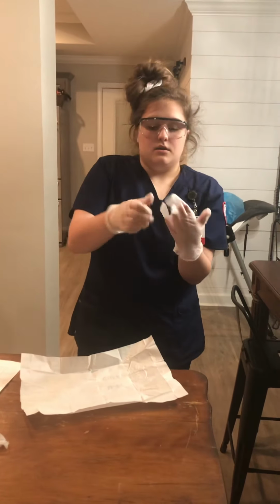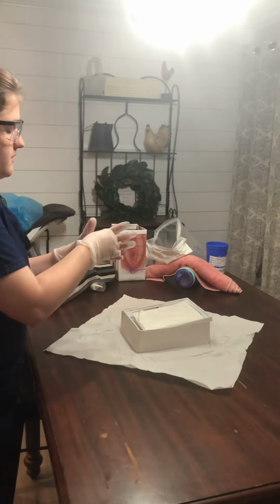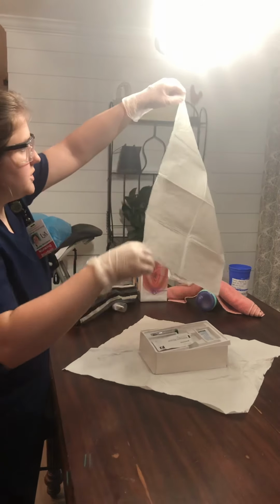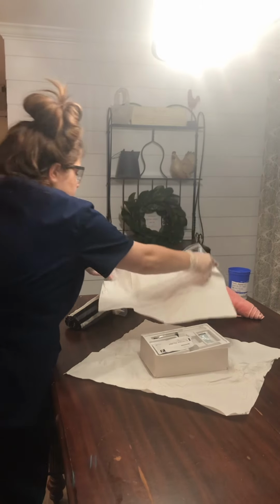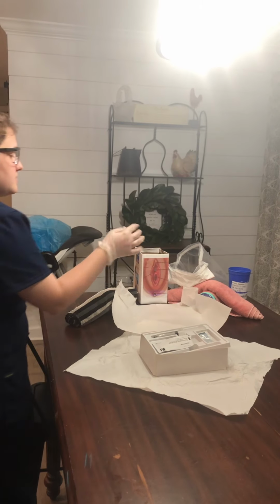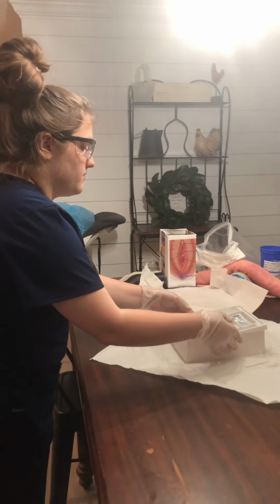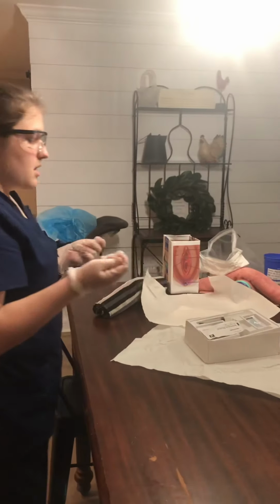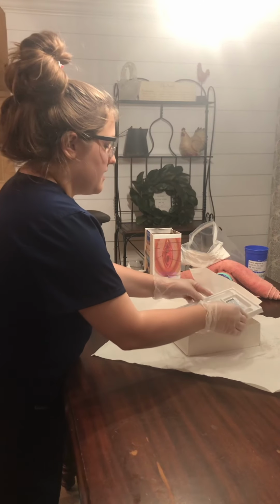Okay. So now I'm going to take my sterile field out. I'm going to grab it by my 1-inch border, and then create a barrier for my sterile gloves. My fingertip did touch the patient's leg, so that would be a break in sterility. Okay, so I have no gap. Now I'm going to take my tray out.